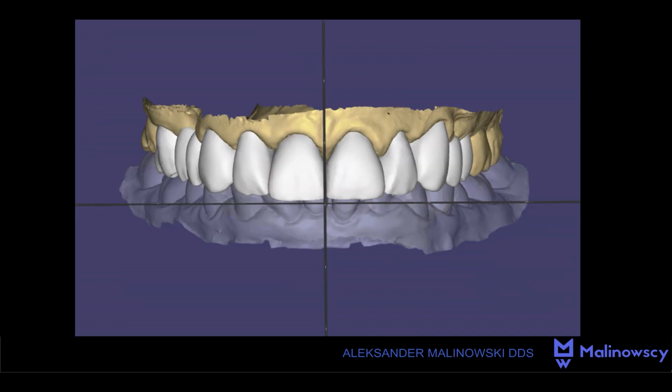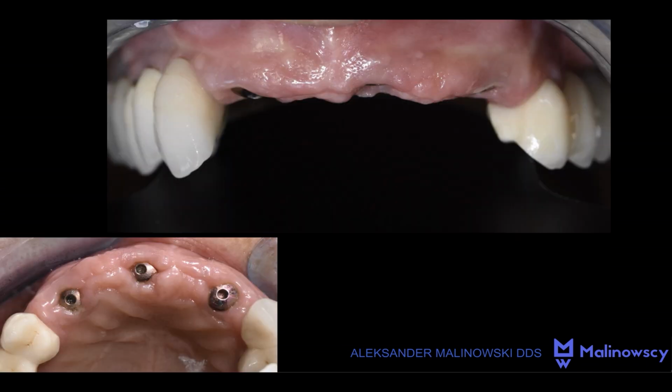Here you can see the corrected design, where the teeth from both sides have similar sizes. And this is the last case where we have used the planes also.